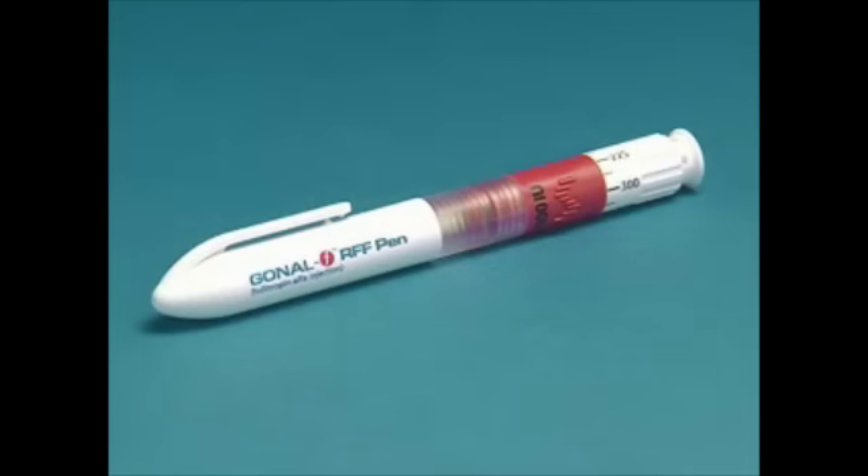Take a moment to examine the pen and the medication. The pen should be at room temperature, and the medication in the pen should be clear. If it is not clear, or if the medication contains any particles, do not use it. Instead, call your doctor, nurse, or pharmacist.